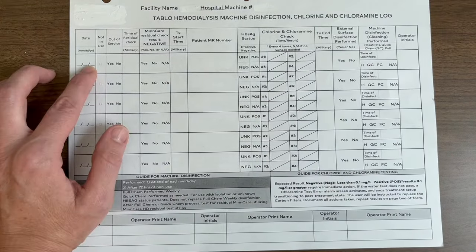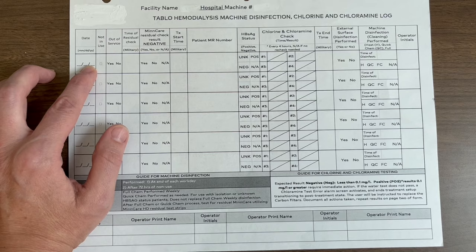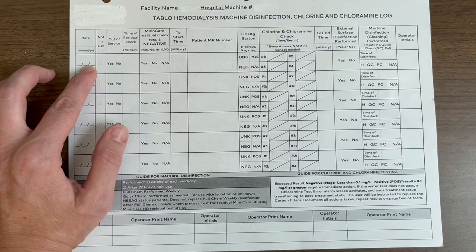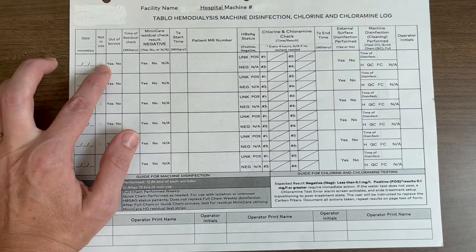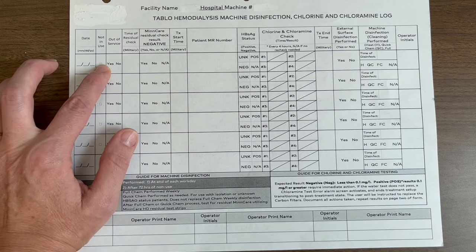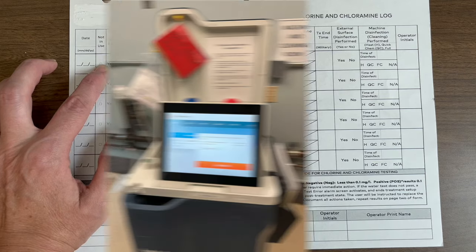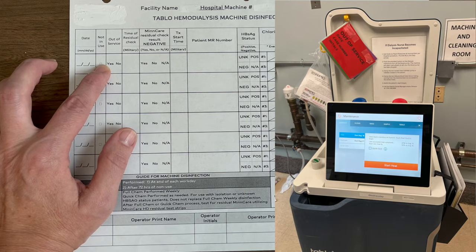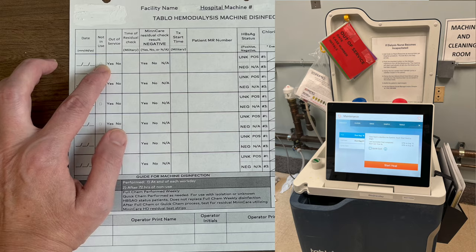Next, you'll see the box 'not in use,' which means the machine is being checked that day by the dialysis nurse but is not currently in patient use. Next, we have 'out of service,' which means the machine is not in service. Out-of-service machines will be identified by the sign on the machine that says out of service.